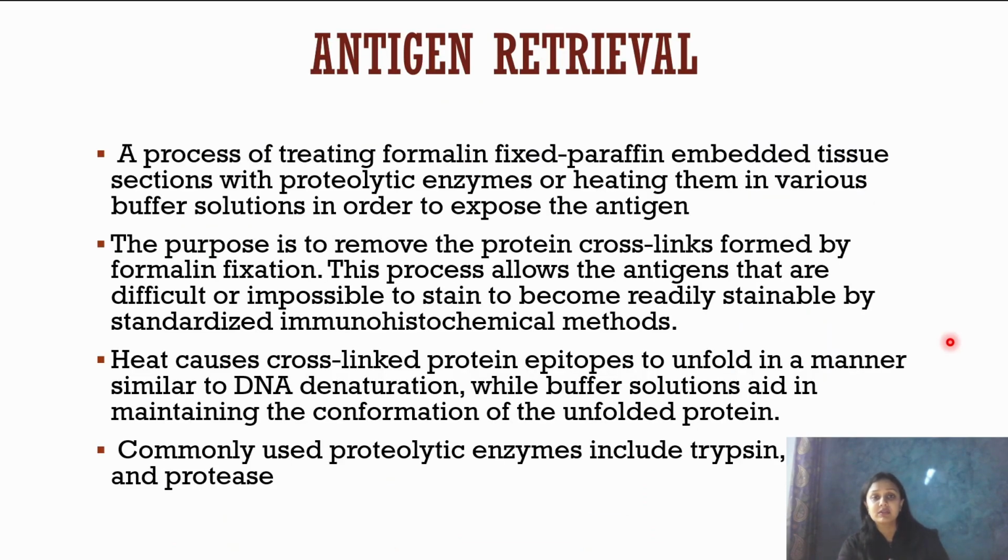So just imagine, right? You've gotten your tissue sample, you have fixed that tissue sample properly, and after fixing, you've made a proper block of it, you've sliced it. After slicing, there is still paraffin attached to it. So you have deparaffinized it and rehydrated. After this process comes the process of antigen retrieval as well as blocking of endogenous enzymes. So, what exactly do you mean by antigen retrieval?